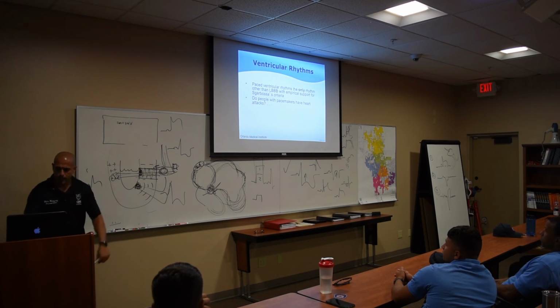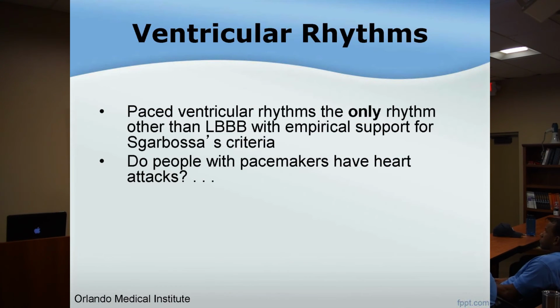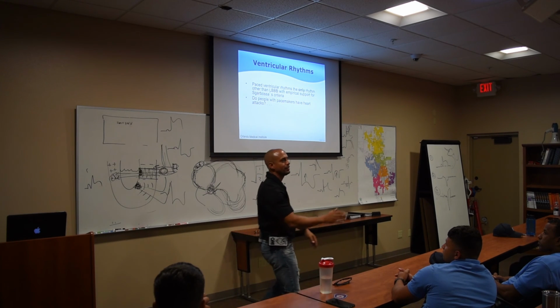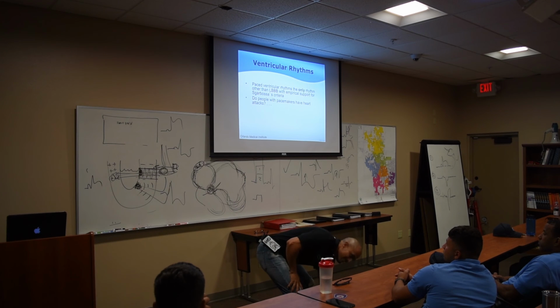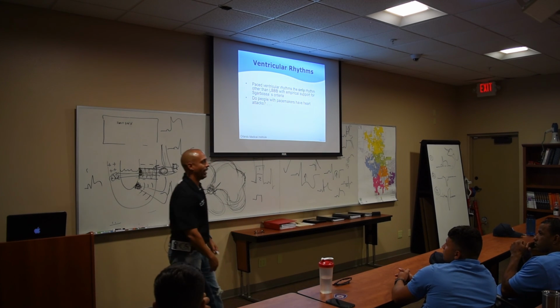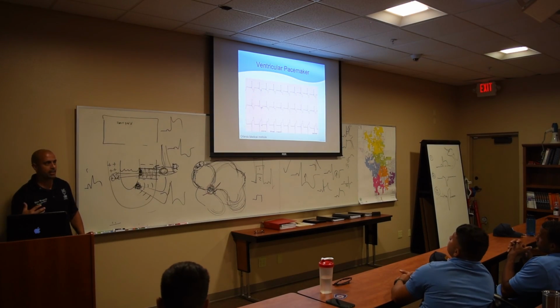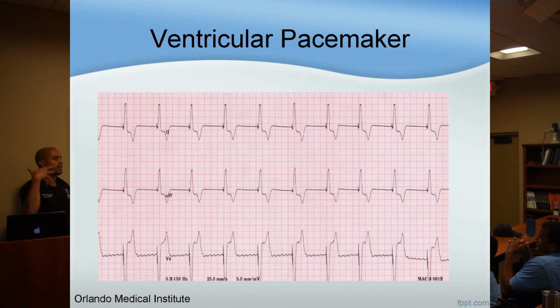Ventricular pacers. If I have a pacemaker, can I have a heart attack? Having a ventricular pacer doesn't automatically mean you aren't prone to having MIs. You're most likely going to have an MI. But then we say, oh yeah, it's a ventricular pacer, he's good, sign of refusal. So why? He's diaphoretic. So ventricular pacers have MIs as well. What can you use to determine if it's a true MI with a ventricular pacer? Sgarbossa.